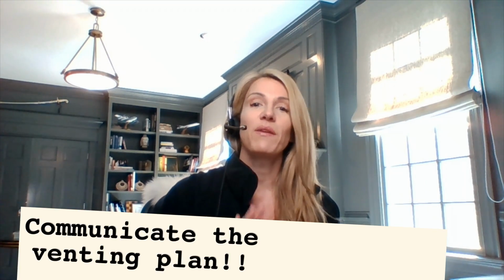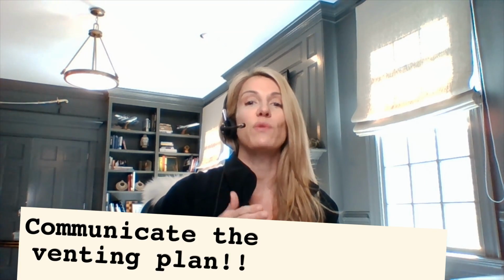Whatever you decide, make sure that it's communicated to everyone who's feeding your child, to make sure that your child is consistently comfortable during the feedings. Okay, so once you vent, there's a couple of things to keep in mind.